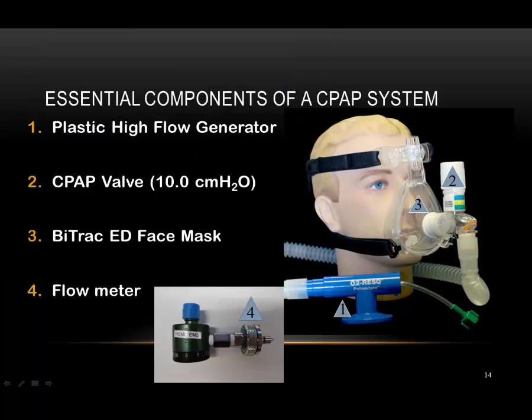The resistor, either set at a specific threshold level or adjustable to a required level, will provide a resistance to the flow through the circuit, allowing the pressure to elevate within the whole respiratory tract up to the prescribed level. The circuit pressure will be maintained at this threshold level only if the valve remains open. This is only achieved by ensuring flow constantly passes through the valve. Ideally, the valve should be flow independent and thus prevent large swings in the circuit pressure from the intended level. CPAP delivery is affected by the quality of these two components. The goal is to deliver CPAP without circuit pressure changes.